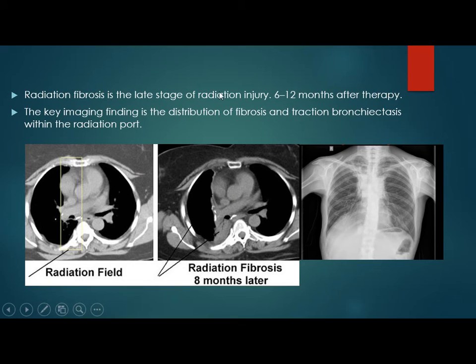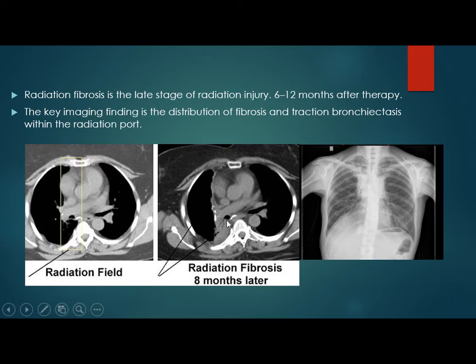Radiation fibrosis is a later stage of radiation injury, occurring about 6 to 12 months after therapy. The key imaging finding is the distribution of fibrosis and traction bronchiectasis within the radiation port. The radiation field causes fibrosis and decrease in lung volume, seen here after eight months.